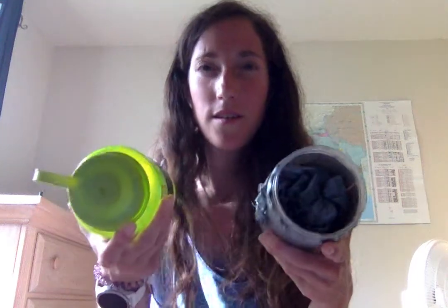So I started looking for alternative options, and I found this container on Amazon. This is a clear container. I just covered it in duct tape to make it a little bit more discreet. But if you look here, again, it's got that wider opening, so it's a little bit easier to empty into.